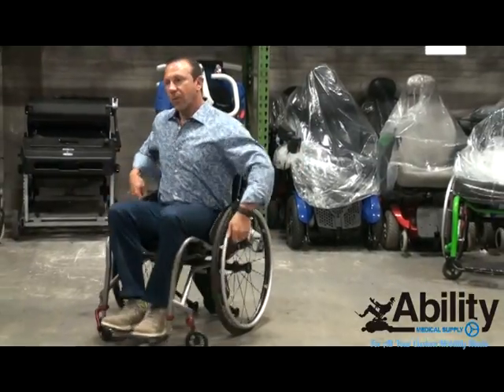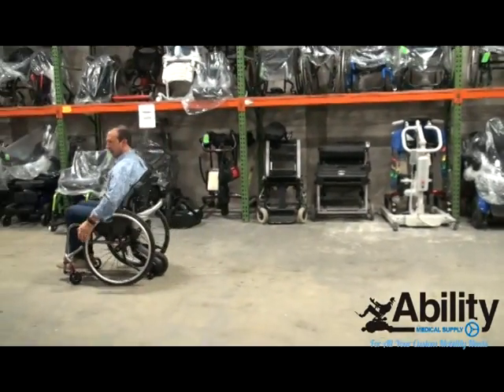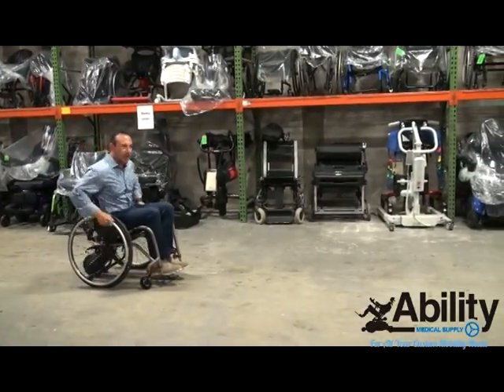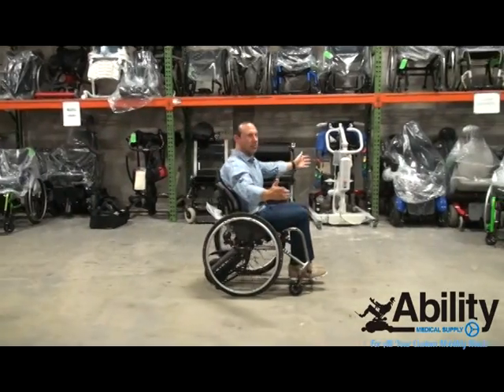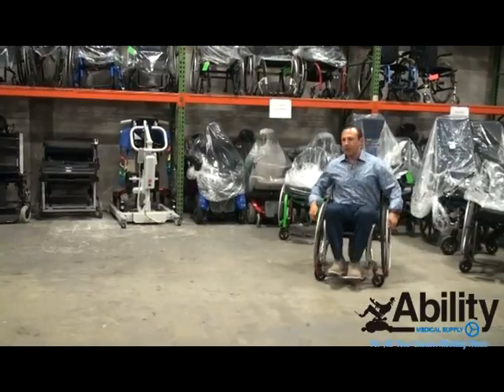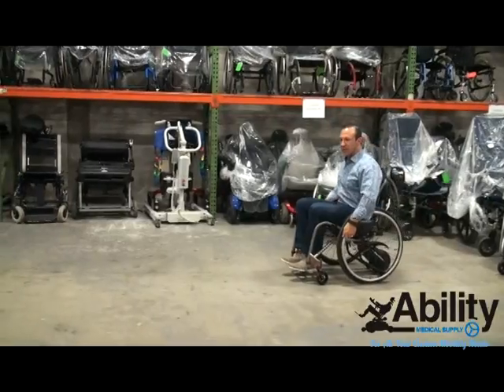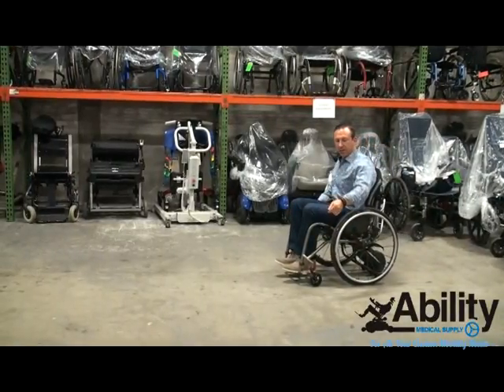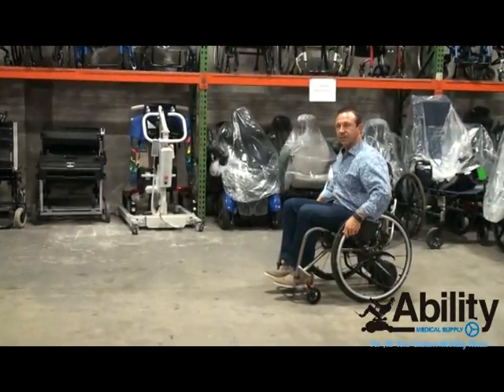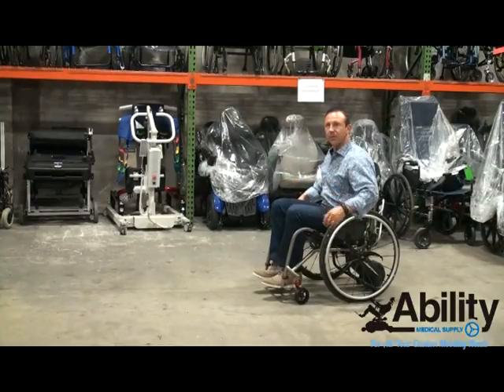And then, with a simple push, the chair rolls all on its own. In order to disengage the motor from continuing to push you forward, you need to do a simple motion with the wristband, like so, and it will enable you to stop the unit. If you don't do this, it will keep going. And it's a very powerful piece of equipment.